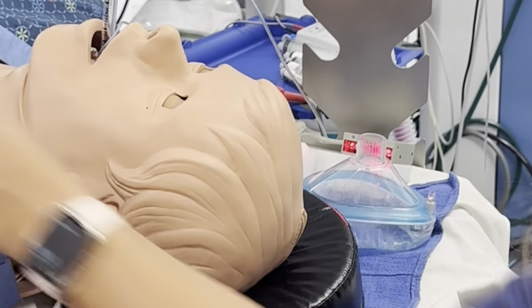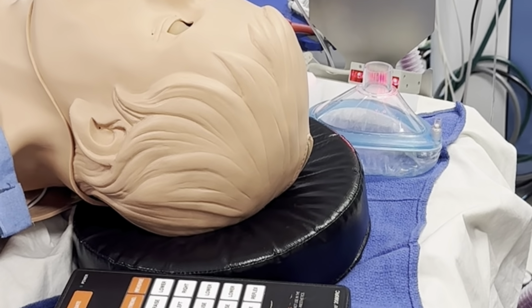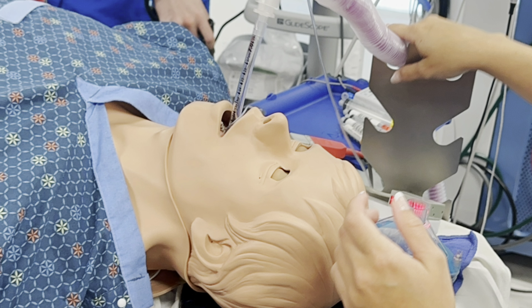Make sure you listen to their breath sounds, and then we can go ahead and turn them onto the ventilator. Those drugs we gave in the IV only last for a period of time. So to keep the patient asleep, we also give the anesthesia gas, sevoflurane, isoflurane. That keeps the patient asleep. So we're monitoring how much gas you're getting, how much fluids you're getting, all your vital signs, we're giving pain medication, and then near the end of surgery, we're also gonna give some anti-nausea meds and wake the patient up.